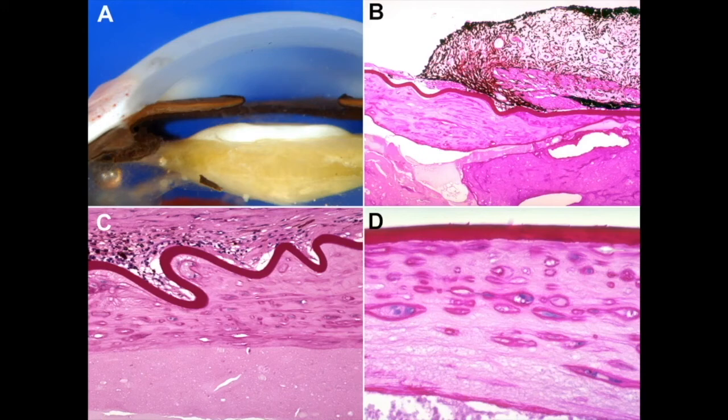Another example, at top left, we see a patient with neovascular glaucoma and prominent ectropion uveae. The white plaque on the surface of the lens is an anterior subcapsular cataract. We can see the cataract beneath an area of posterior synechia formation. We can see our PAS stains.